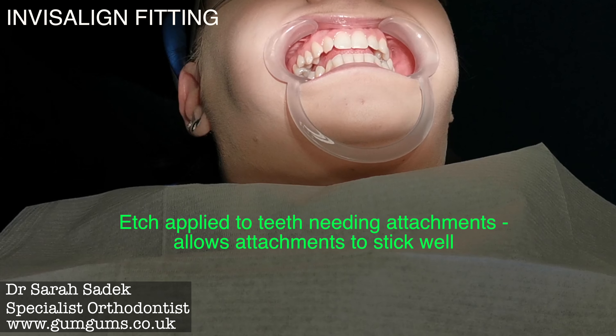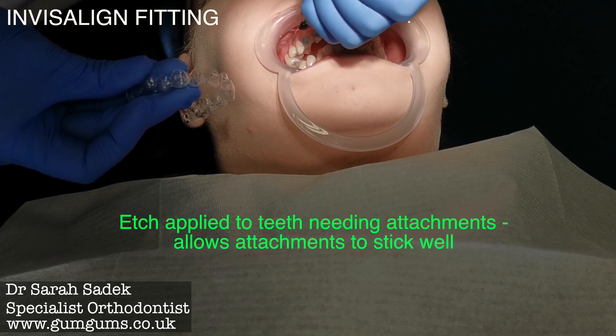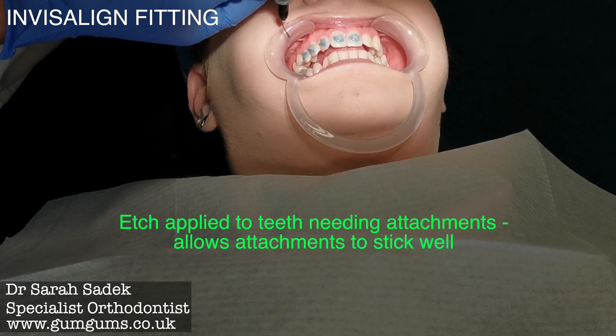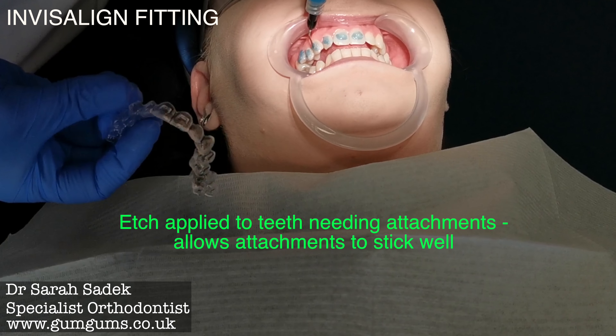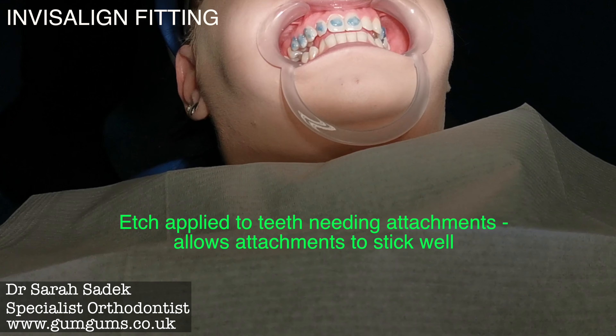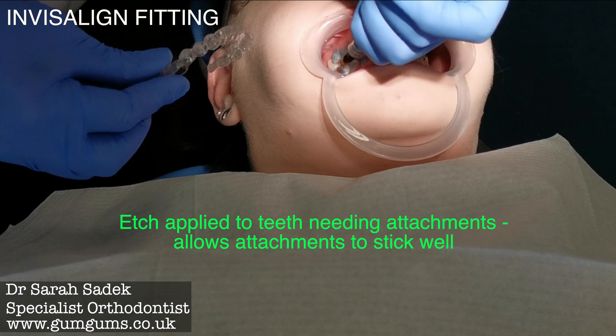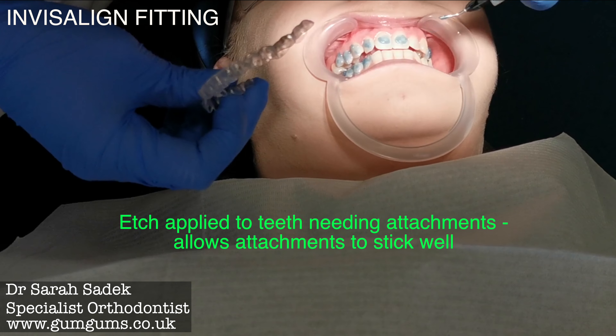The first thing we will do is isolate your teeth and apply an etch. This cleanses your teeth and makes them temporarily more porous to allow the attachments to stick well. The etch is applied to all teeth that will have attachments fitted, left on for a few seconds, and rinsed off thoroughly.